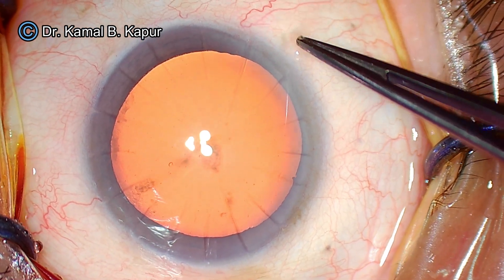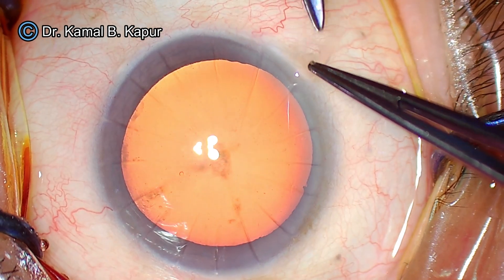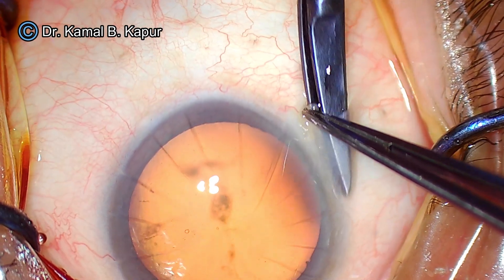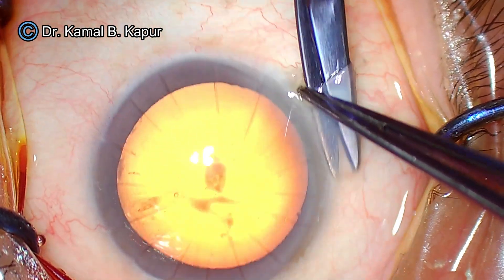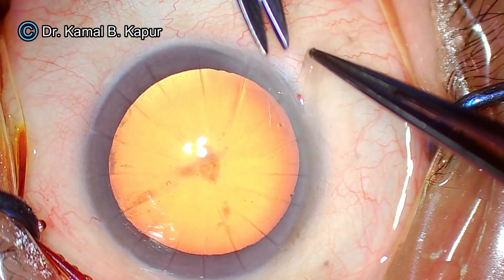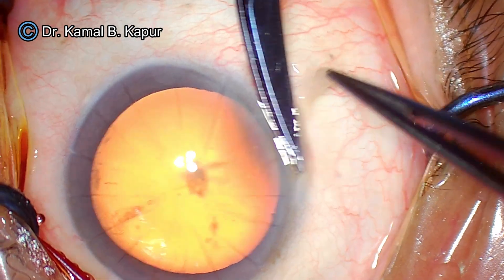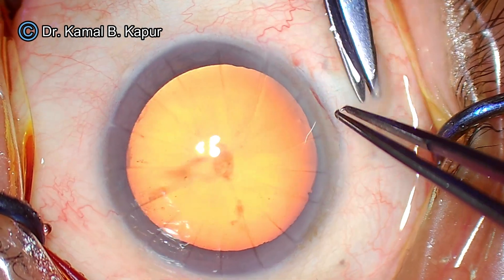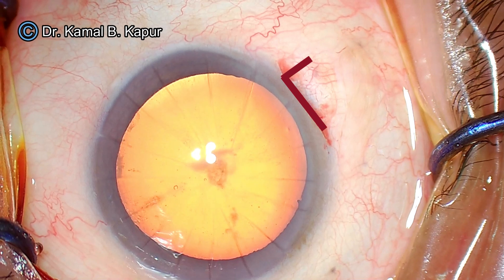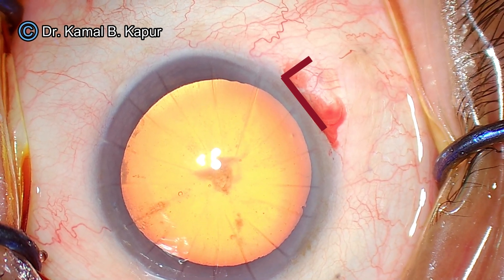Now we proceed in this particular case by doing the incision. We make an L-shaped cut in the conjunctival flap just to ensure very adequate closure. You will notice at the end of the surgery how this L-shaped flap on the conjunctiva helps us.